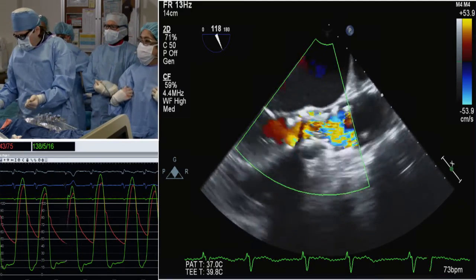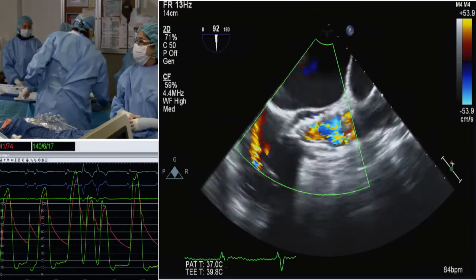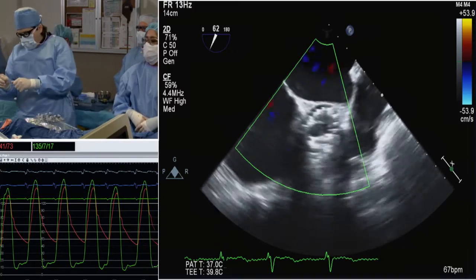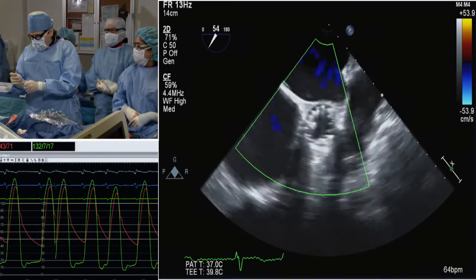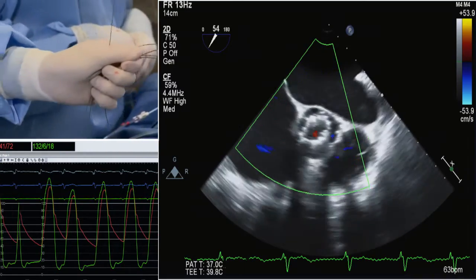And the last thing you want in that patient is to rush through your deployment of a self-expanding valve. I would say in this particular case, I probably wouldn't have predilated. My decision would have been predicated on the fact there was some LV dysfunction, but it's not horrible. Although there is a lot of calcification, it's not in the LVOT and it's in the leaflets.